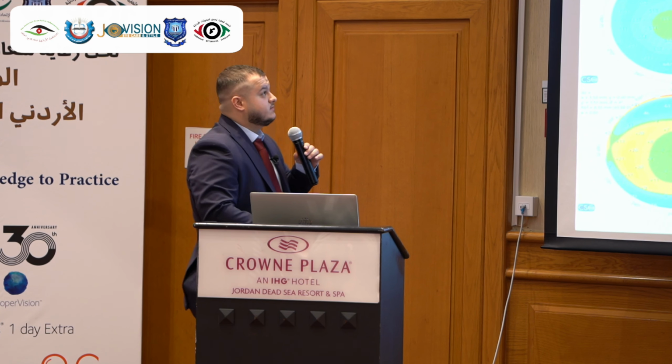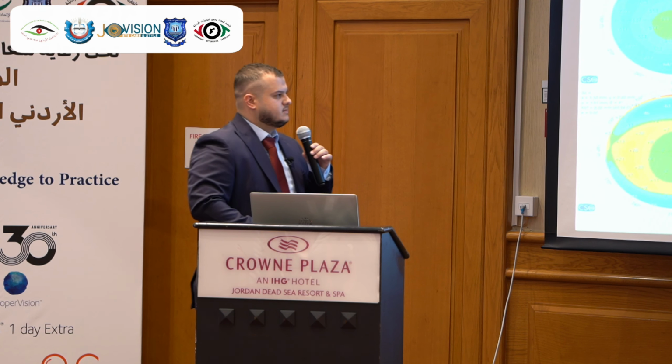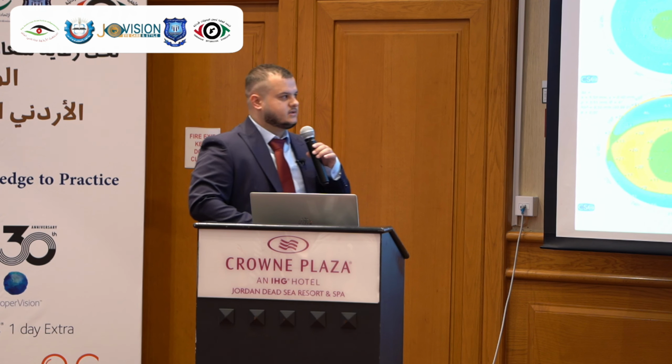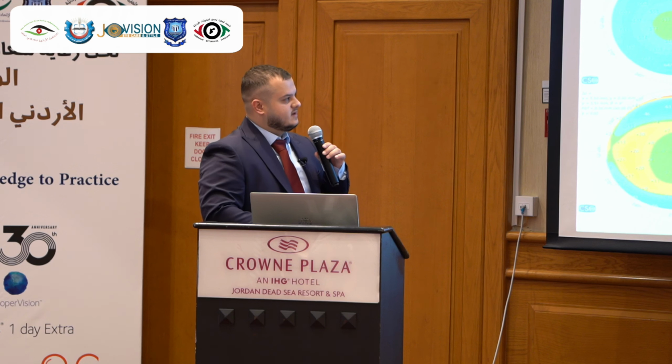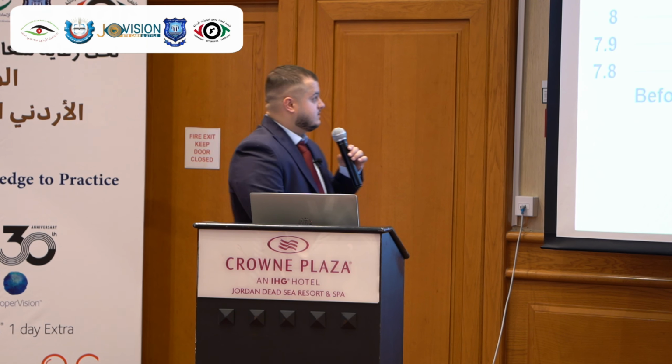This is the corneal topography for the patient. She has myopia, no astigmatism here, after using Ortho-K for 1 year, flat center and hyperopic peripheral. This is the corneal 3D. In this case, the same thing.